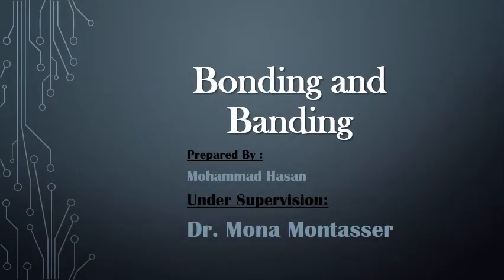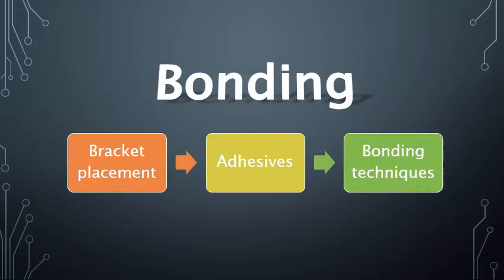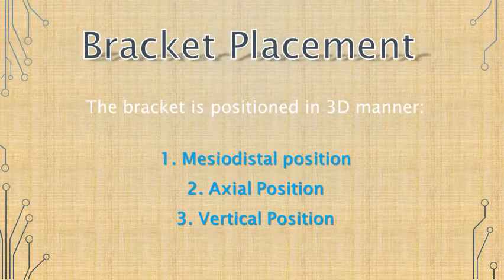Bonding and banding in orthodontics. Bonding will include bracket placement, adhesives, and bonding techniques. The bracket is positioned in a 3D manner: mesiodistal position, axial position, and vertical position.